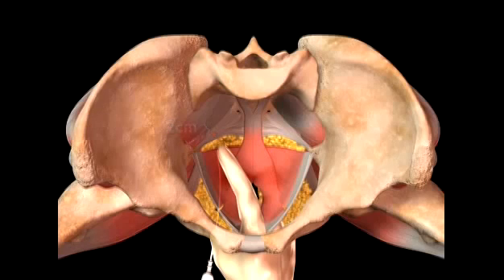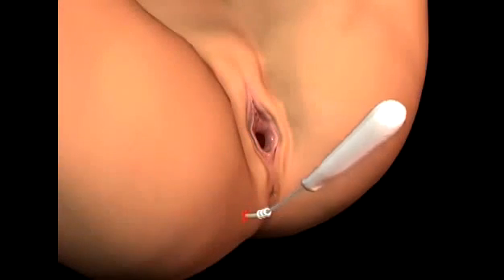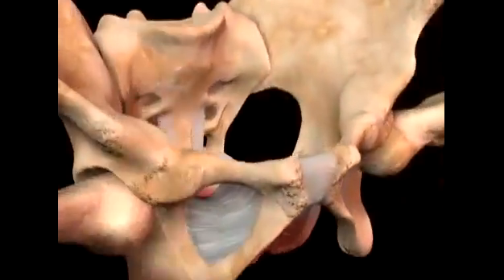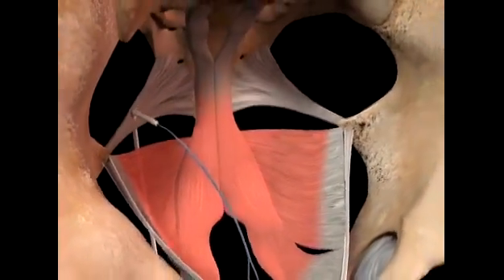The cannula-equipped guide perforates the mid-portion of the sacrospinous ligament and enters the rectovaginal space. With the cannula held in place, the guide is carefully removed, and the retrieval device is passed through the cannula. The retrieval device is retrieved from the rectovaginal space and affixed outside the vagina on the surgical drape.